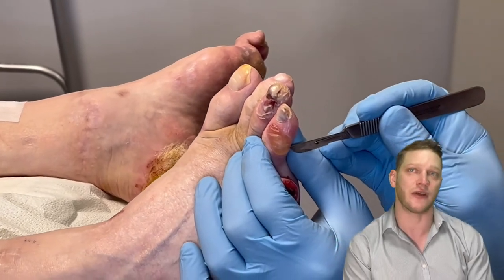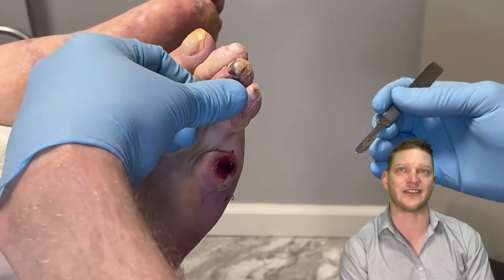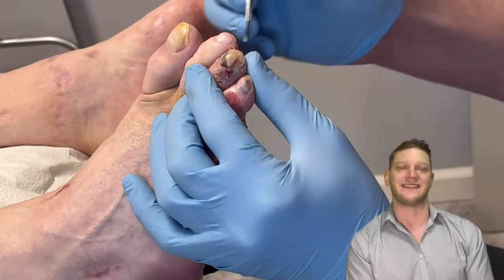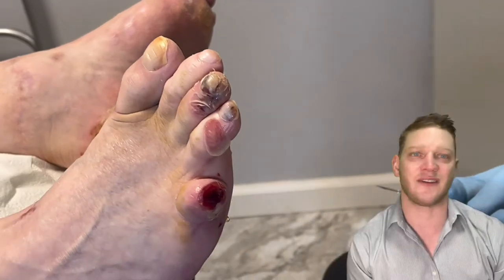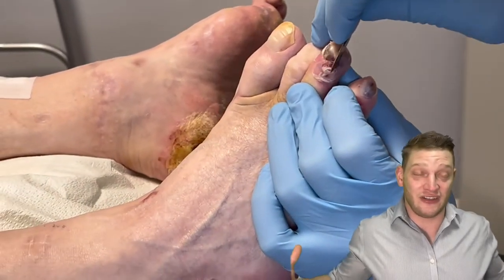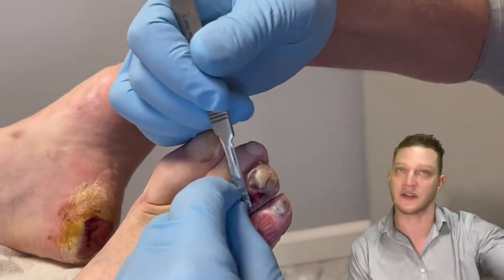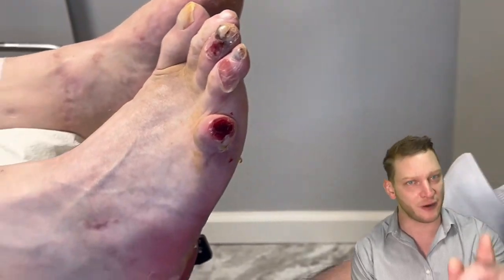Now on to the third toe — there's what looks like necrosis and the nail is loose. I'm going to remove any necrotic tissue. Necrotic tissue is another buffet for bacteria; it is not going to reattach to the body by any means — the body is going to reject it. Cut it out for the patient. See what's underneath. If it's a big giant abscess or if it's bones staring you in the face, you better know about that.